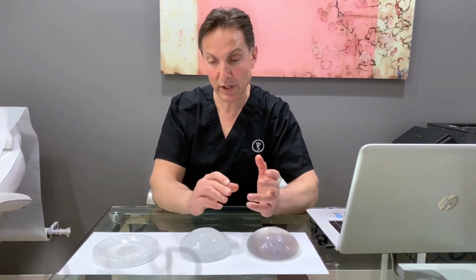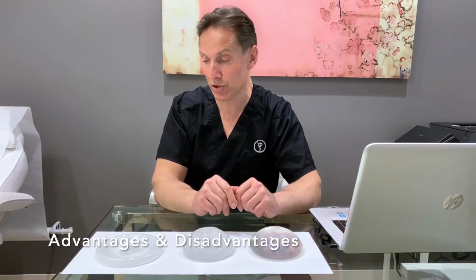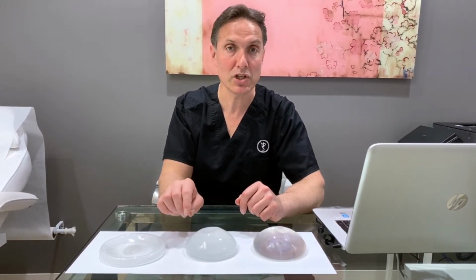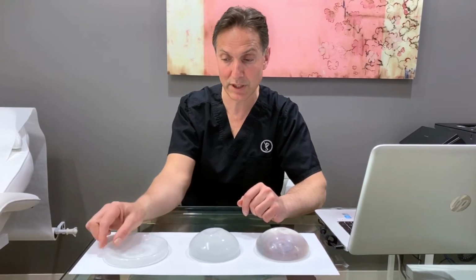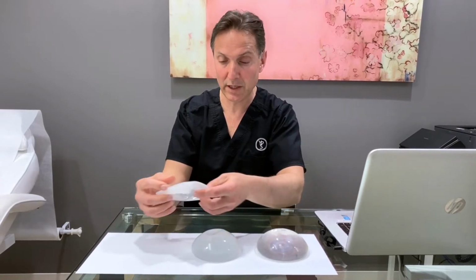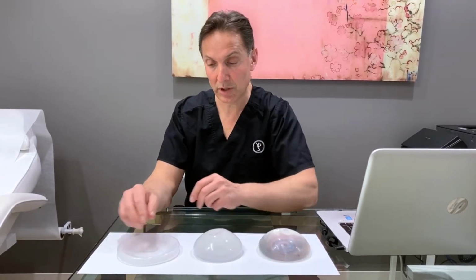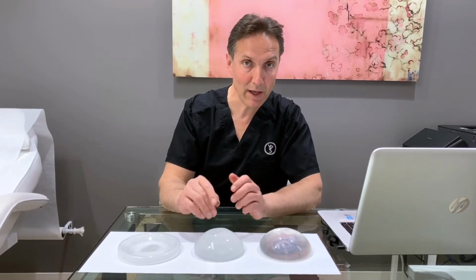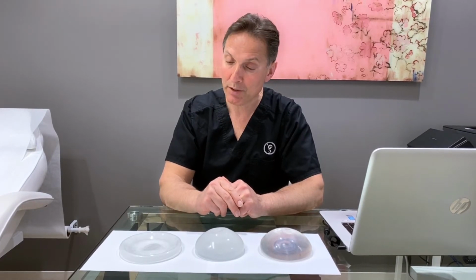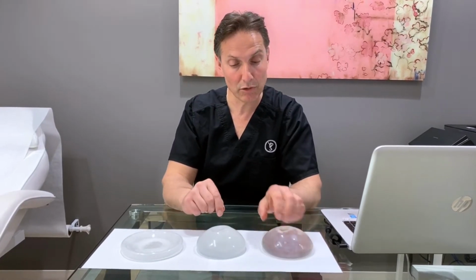There are some unique advantages and disadvantages. Again, this should be discussed in person with your plastic surgeon, but I think a saline implant can potentially be inserted through a slightly smaller incision because you can roll it up and insert it and then inflate it, so that's an advantage. And you can adjust it so you can make one side bigger than the other. That's another major advantage. They're a little less expensive. Some papers have suggested that they are less likely to cause scar tissue around them called capsular contractures, so that's important. They do have a higher breakage rate than silicone implants, though.